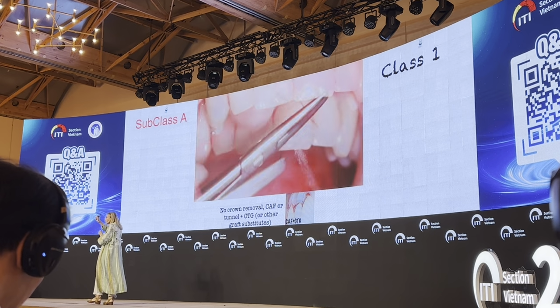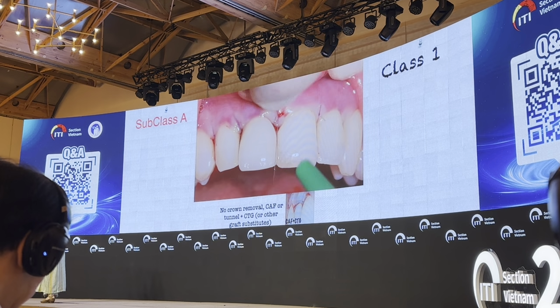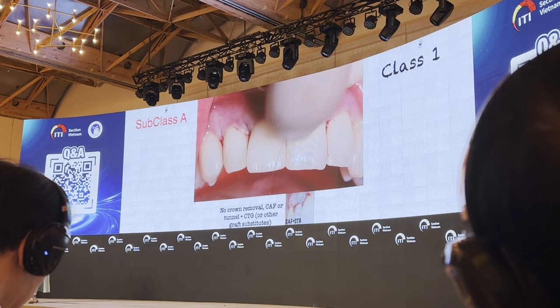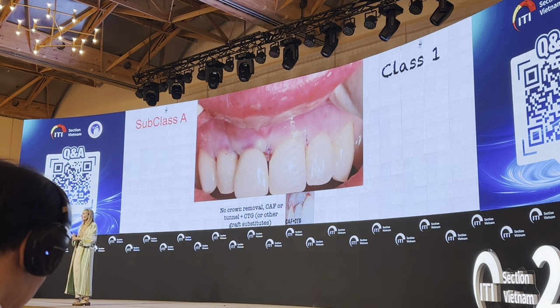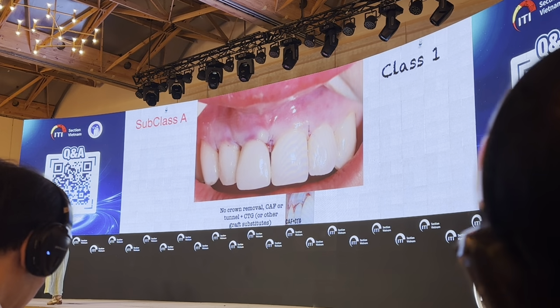So when I pull the suture, I don't have the risk to break the soft tissue. If I pull too much, I will break the suture. That costs a lot, but it's better to break the suture instead of the soft tissue, especially at the end of the surgical procedure. And so you see, no bleeding at all.